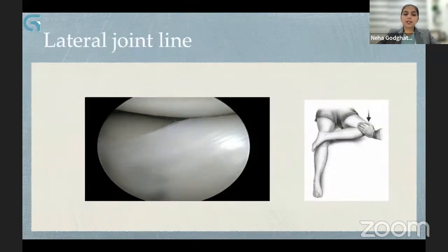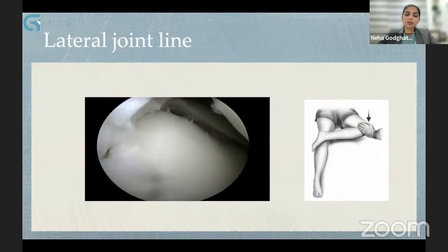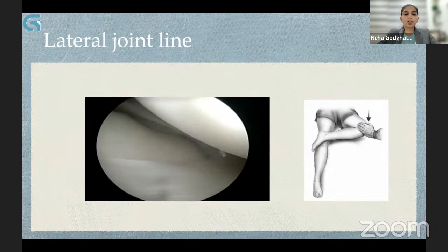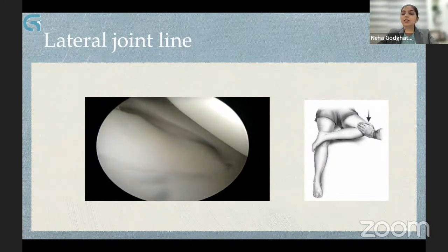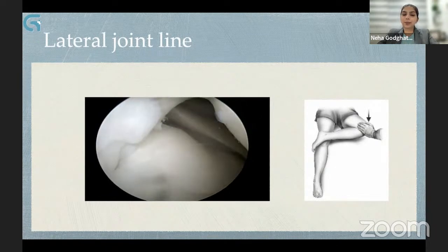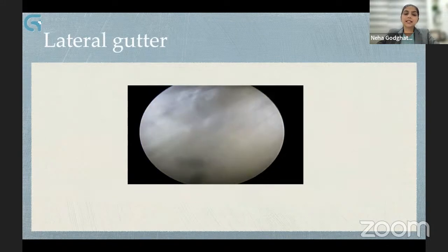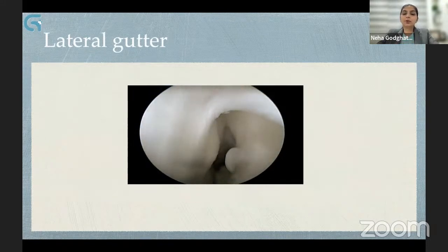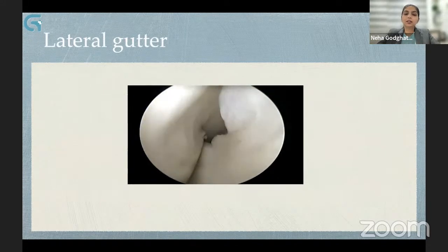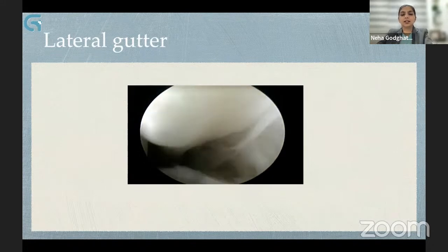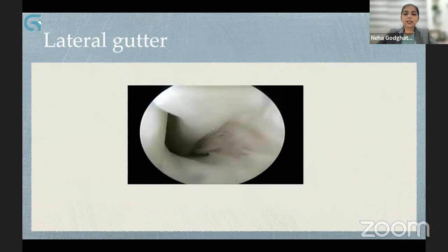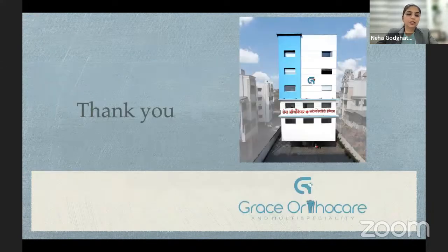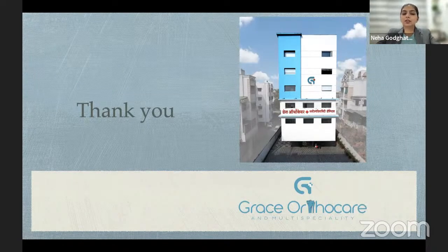The medial meniscus can be well visualized by giving a valgus and external rotation force on the knee. With the help of the probe we can palpate the undersurface of the meniscus, the meniscocapsular junction, and sometimes diagnose hidden lesions by probing. The knee is then gradually flexed to see the ACL — the scope moves to the intercondylar notch. A novice arthroscopic surgeon may think the ligamentum mucosum is the ACL, but the ACL is posterior to it. After shaving the mucosum, the ACL is very well visualized. The arthroscope is then advanced in the lateral joint line to examine the lateral meniscus, popliteus hiatus, and condyles. The lateral compartment is better visualized with the knee in figure-of-four position. The lateral gutter is then examined, showing the popliteus tendon and posterolateral corner. With this, we finish our basic diagnostic round of the knee joint.